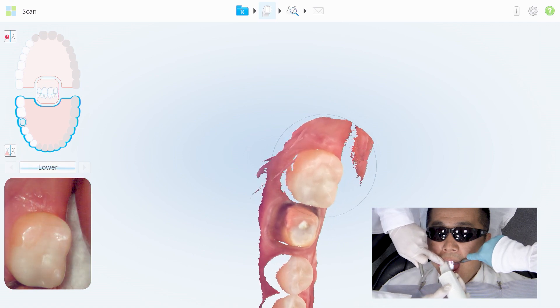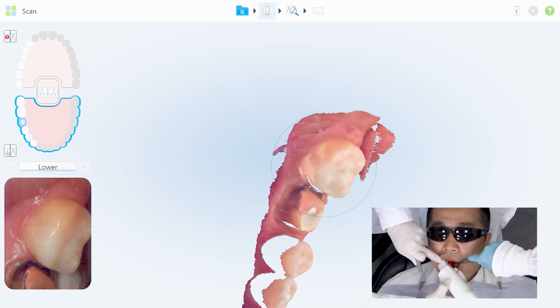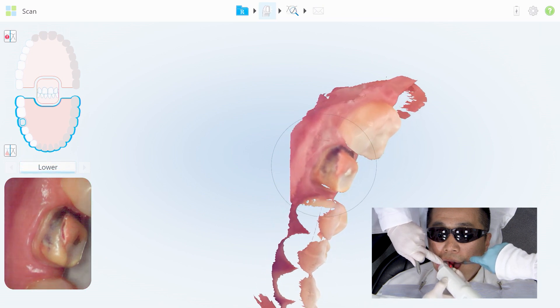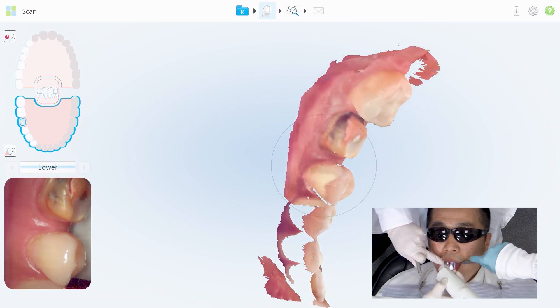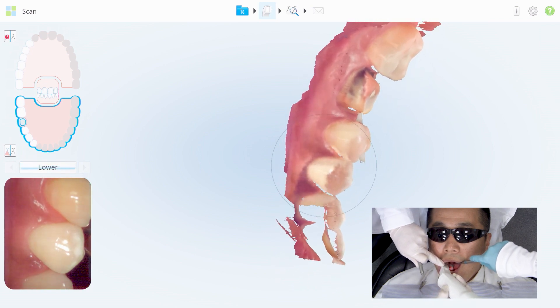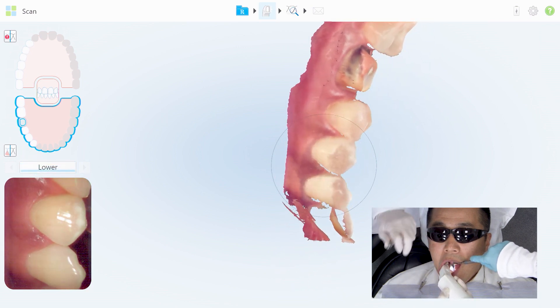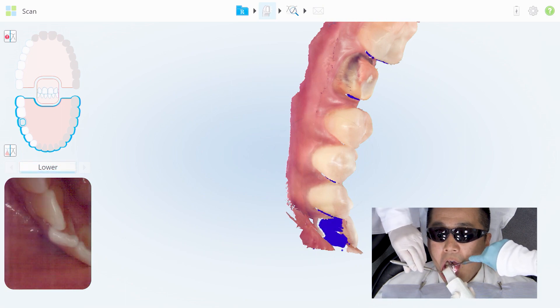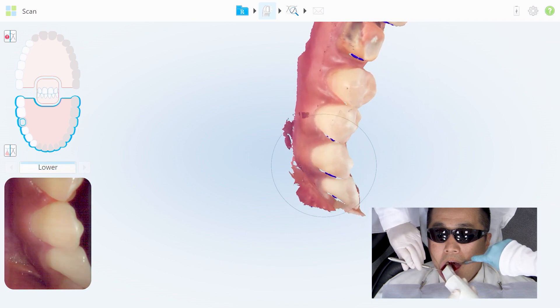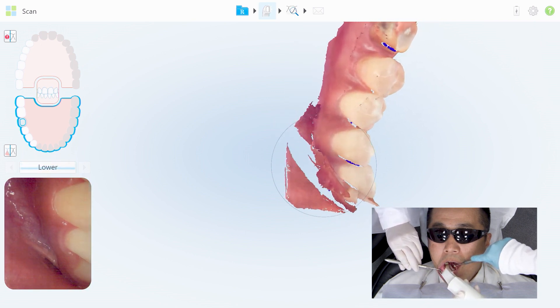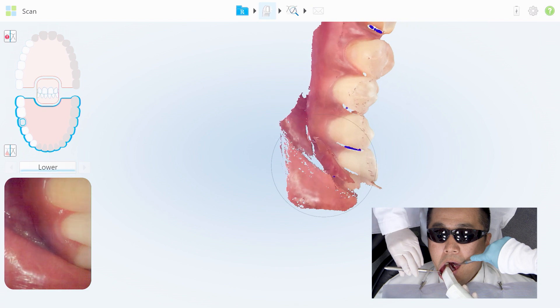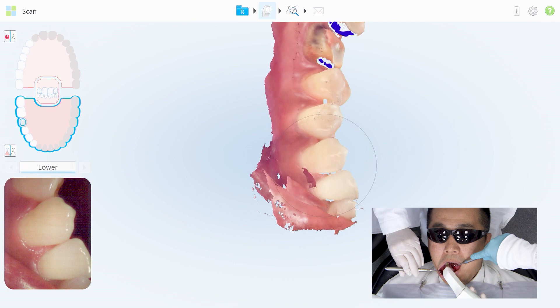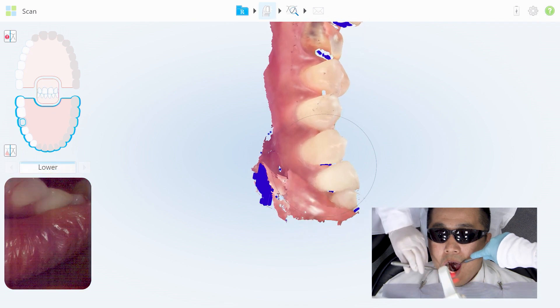On the buccal side, I'll remove the mirror for buccal retraction and just allow the camera access and the ability to retract the soft tissue for me. As I work my way toward the mesial, the camera has less ability to retract the lower lip, so I may need to go back in there and have the patient close slightly. Once they close, it actually releases some of the soft tissue so you can rotate and visualize these areas near the anterior region and allows for that retraction.